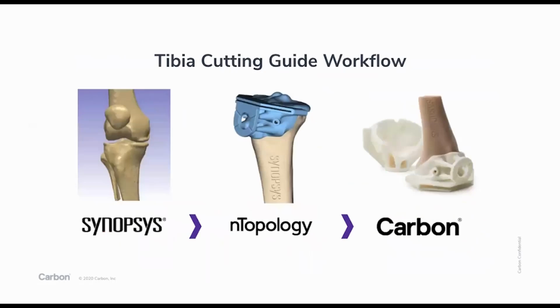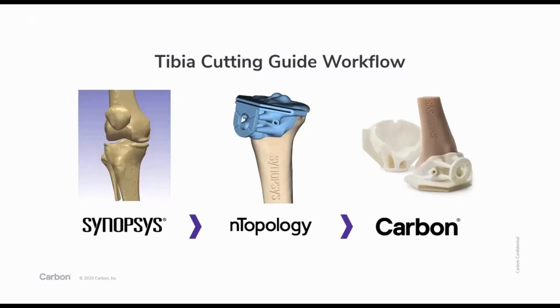Today, we're going to talk primarily about the transition from digital idea to final physical part using one of our resins, MPU 100. I'm going to let Allison talk about what comes next. Off to you. Thanks, Steve. As Steve mentioned, my name is Allison Burrell, and I'm an applications engineer at Carbon, focusing on MedTech.